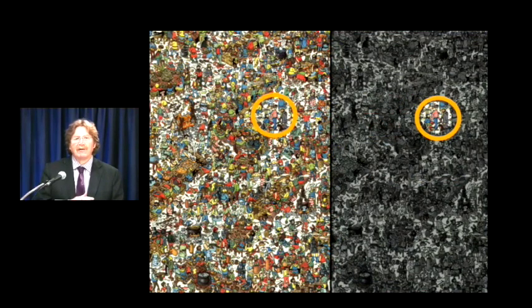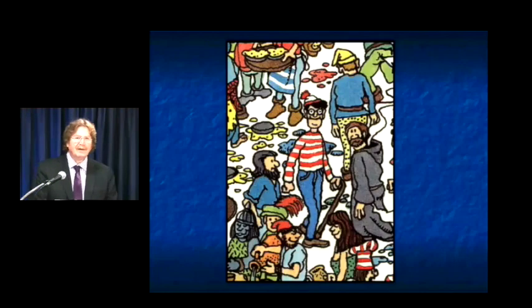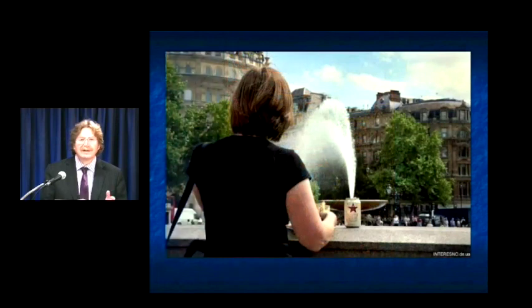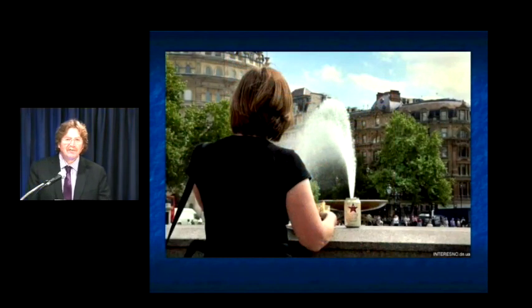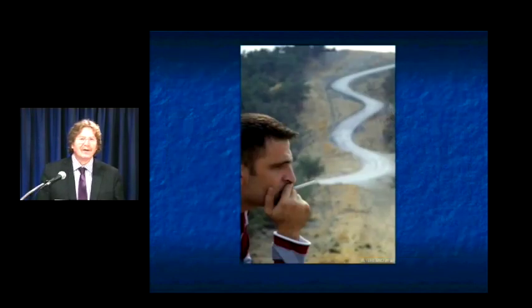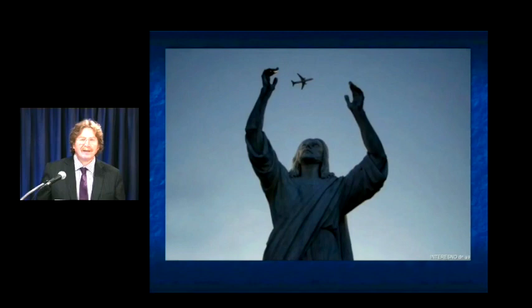And that's very much how we think about CT or imaging in general. Once you know what to look for and you know what's important amongst all the noise, it becomes something that's easy to find. And so finding things become critical. And it's also important that we don't misunderstand what we're seeing. A few of those visual perceptions, like this beer can or the cigarette smoke or trying to catch this airplane, make the point that sometimes things aren't always what they seem to be.